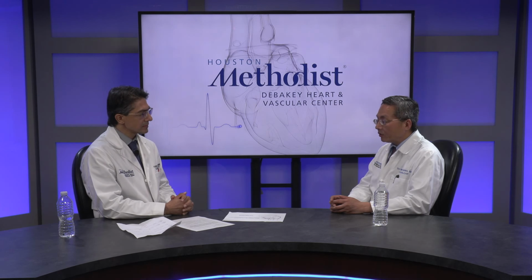This has been reasonably well validated against, for instance, invasive fractional flow reserve. And the performance is very similar to the correlation between invasive fractional flow reserve and, for instance, PET or SPECT. It's not a perfect correlation, and there are some caveats we can discuss later.